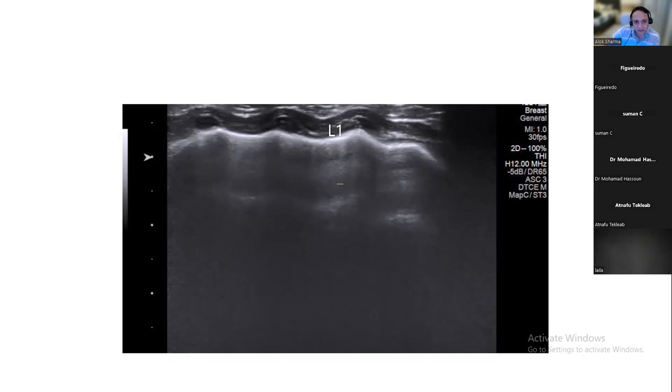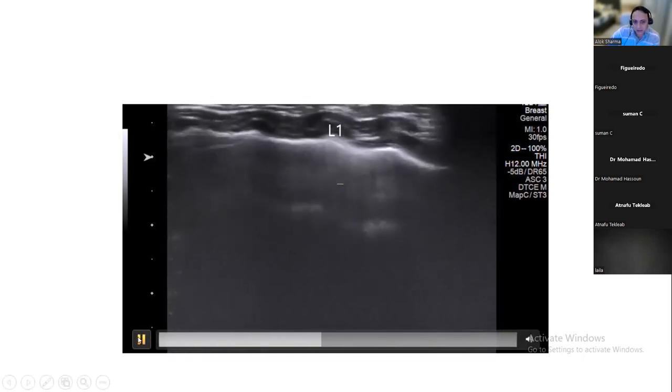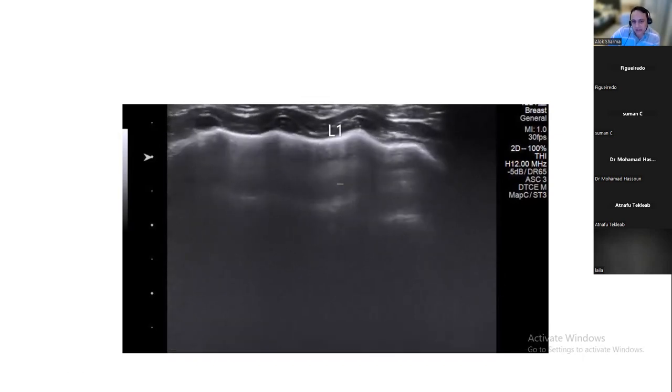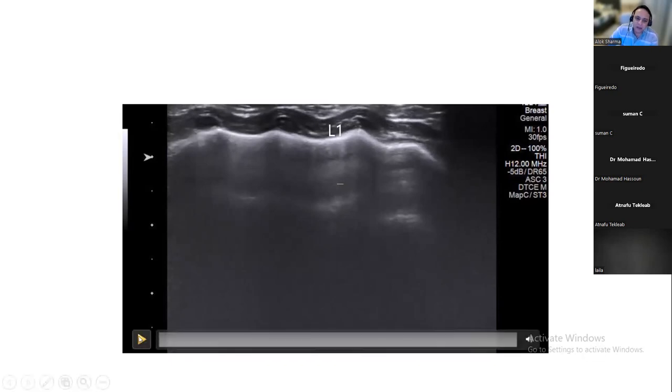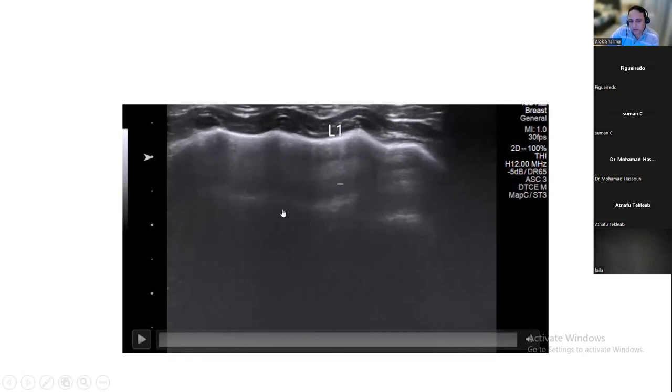Your contact is definitely fine because the ribs are completely, I would say, in unison. The pleura is completely continuous with good sliding. So the superficial areas of the lung I can delineate. But I think the blurred nature of the image is probably because your probe is on the older side. And it's whether we can play a little bit with the settings to try and see.